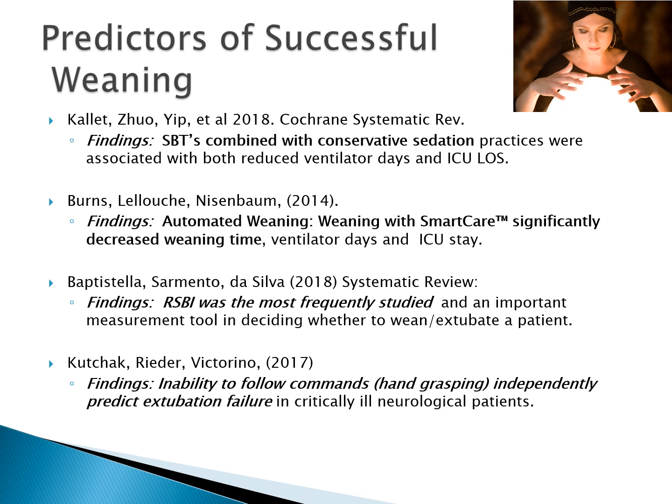Now, I will tell you, in countries outside of the United States, in some cases, the weaning can happen literally automatically. Through an interface, it will determine that criteria has been met. It will reduce the pressure support, etc. As of now, in the United States, the Food and Drug Administration says, "Oh, well, we're okay with SmartCare. It just can't be an automatic thing.